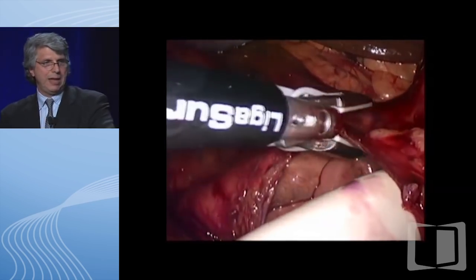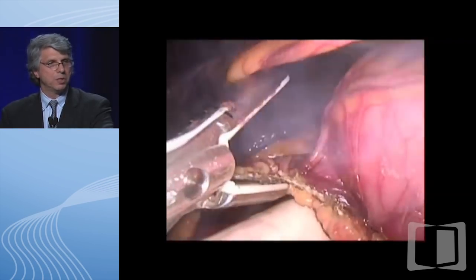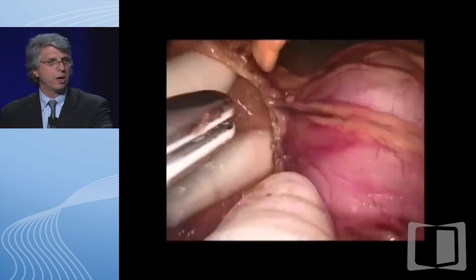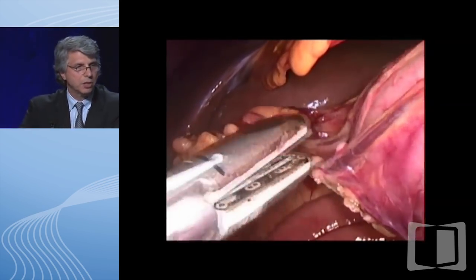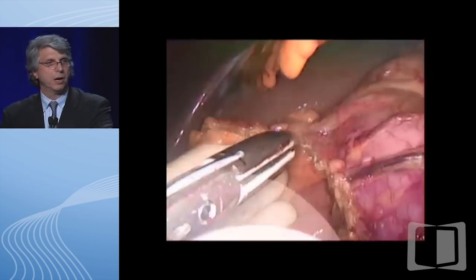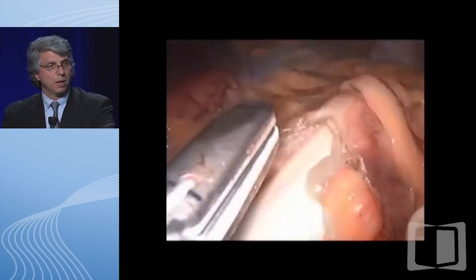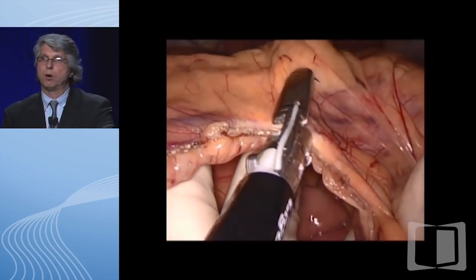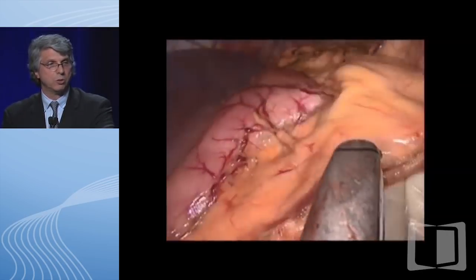We've now taken the mesentery of the right colon. As we take the mesentery, we identify the small bowel below us—that's how we know we're going full thickness through the mesentery. We're now coming across the midline. That structure running across the top is the falciform ligament at the anatomic midline of the abdomen. We're continuing the dissection of the transverse colon mesentery, staying away from the small bowel below. We continue the dissection up to the splenic flexure. This is not cancer—for cancer you have to stay relatively far away from the colon, but when you're doing IBD, you should stay as close to the colon as you can.